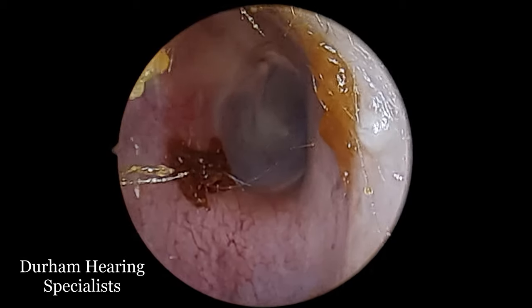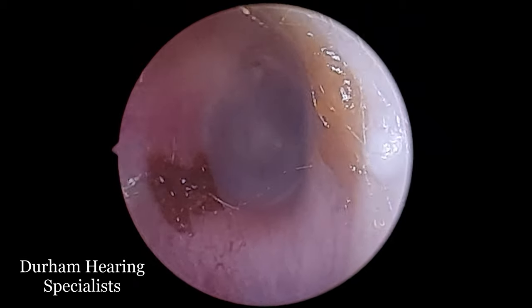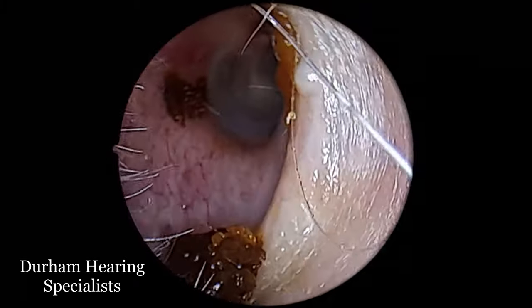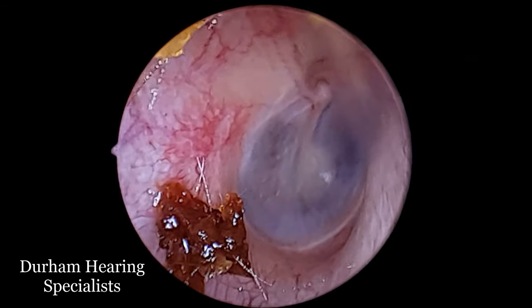There are a few smatterings of wax there. Ideally I would have liked to have left a nice protective coating around the ear canal to defend the patient from infection, but that just wasn't possible. So hopefully these little pieces that I've left in there will defend against foreign bodies and bacteria.